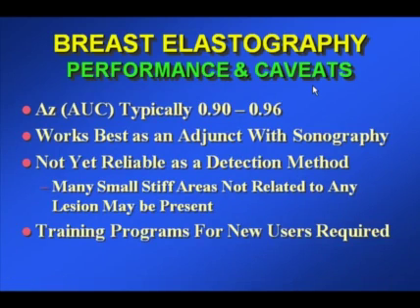So for looking at cysts, you'll have to learn, once you have a system, how a cyst appears on that system, and those rules that apply to that system will not be generalizable to other systems with different elastography software.